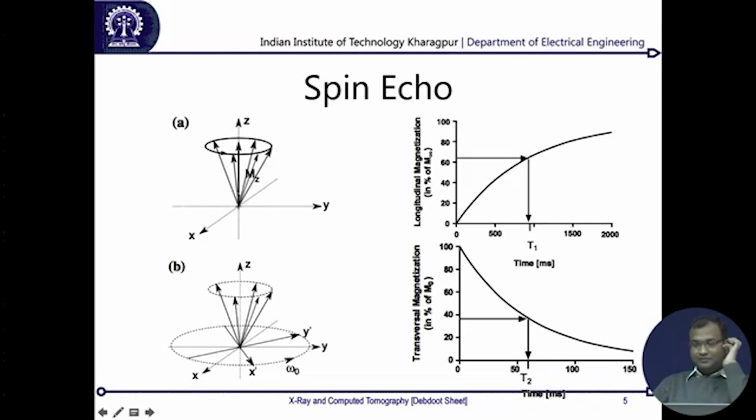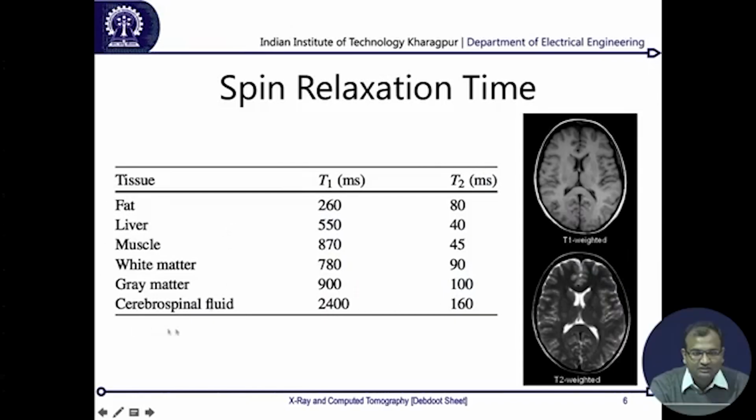Now, if there is a change in magnetic field happening over time, you put two antenna coils in two opposite directions. These antenna coils will be sensing a change in energy as well, and from these antenna readings you get the amount of time it has taken. So if you are looking over a period of time, after some time you will see these sorts of curves. From there we come to what happens with different kinds of materials.